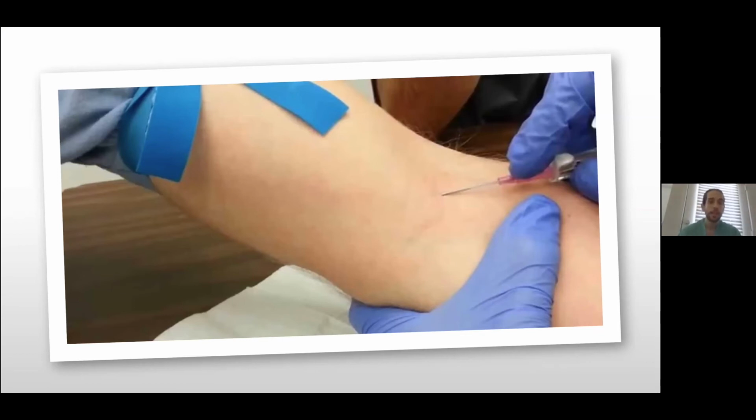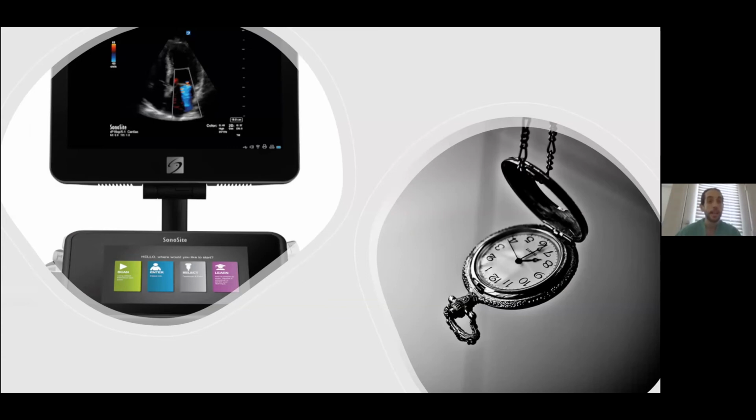The next thing you'll need besides an IV is a machine that has a setting that is able to view contrast enhanced ultrasound. Many of the newer machines have these available. It's a low mechanical index setting. The high mechanical index will disrupt the bubbles and destroy them so that you're not able to see them as well. Not all machines have it, though. Your 1999 Micromax with one probe in the trauma bay that has a broken handle and 3 keys that don't work is probably not going to have the contrast enhanced ultrasound setting available to help you.